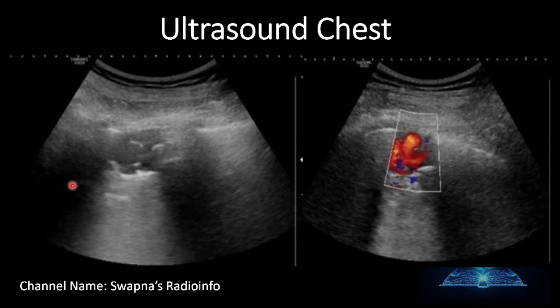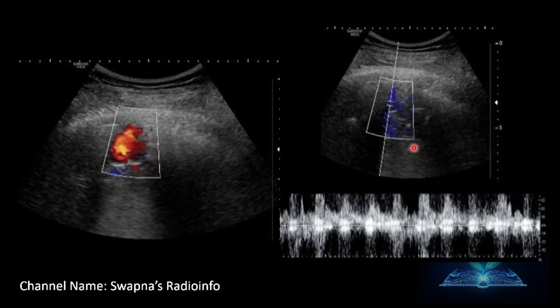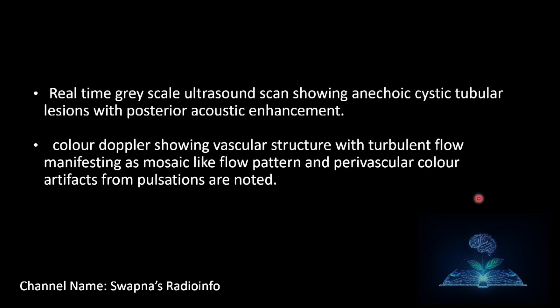Next, ultrasound of the chest was done. It shows anechoic tubular cystic lesions with posterior acoustic enhancement. Color Doppler shows increased mosaic color uptake. On spectral Doppler, a vascular structure with turbulent flow manifesting as a mosaic flow pattern and perivascular color flow artifacts from pulsations were noted.